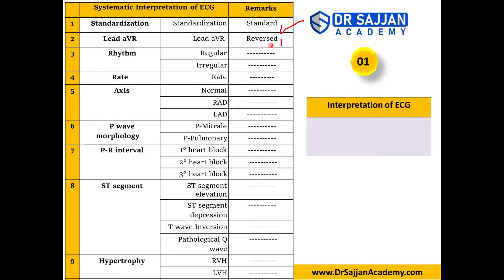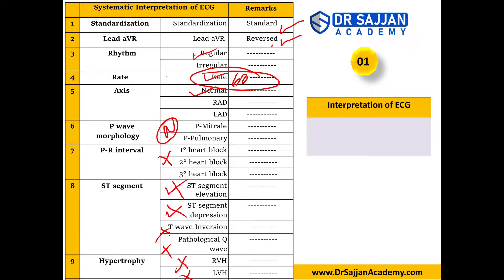Summary of the first ECG: standardization — standard; lead aVR — reversed correctly; rhythm — regular; rate — 60 beats per minute; axis — normal; P wave — normal; ST segment — normal; hypertrophy — not present; bundle branch block — not present. The diagnosis of this ECG is a rate less than or equal to 60 beats per minute — borderline bradycardia with otherwise normal findings.